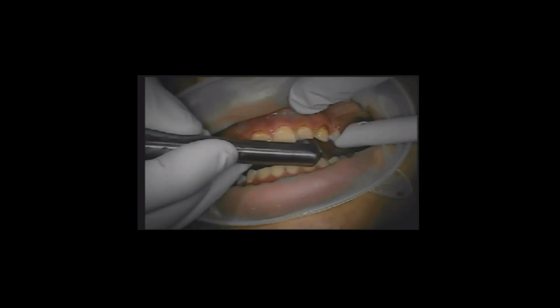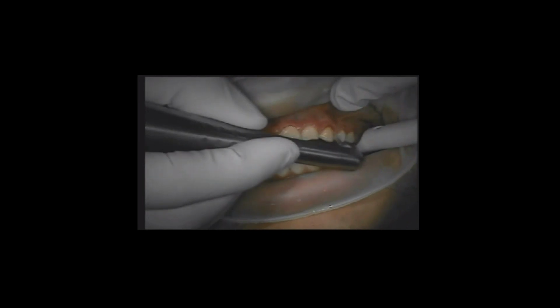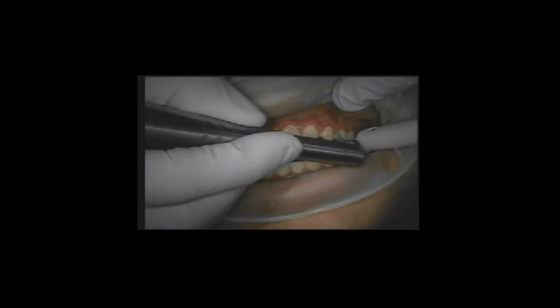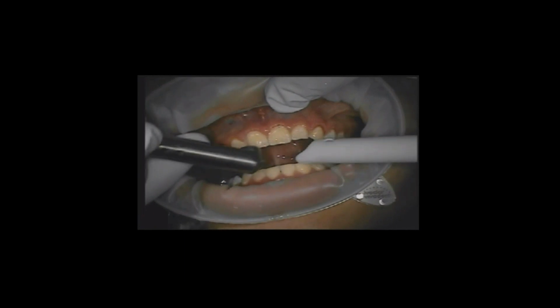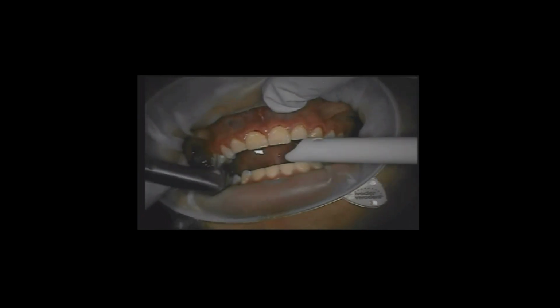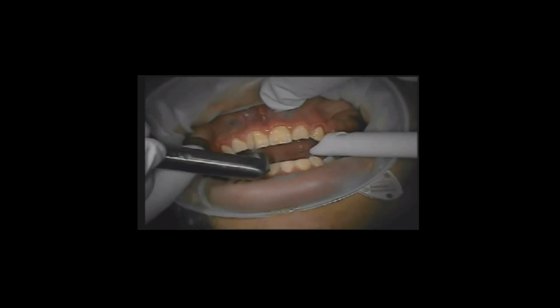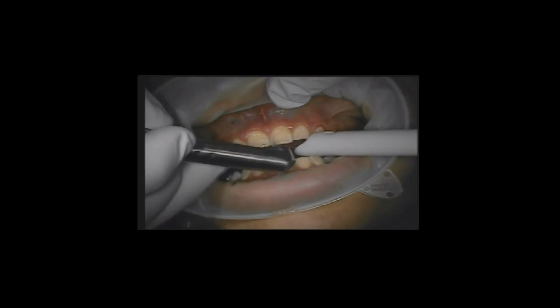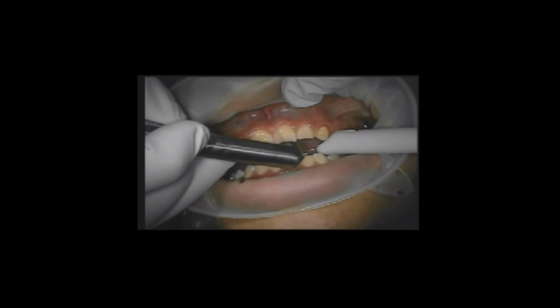So we've gone from doing with no water to now turning the water on a very low setting and just starting to bevel the tissue. So after we trim it to the proper heights, we get a very square edge. Gingival tissue contour is very square, so we want to start to bevel the tissue and do our last little bit of touch-up with it being wet. Again, because, as I said, the zone of necrosis they've shown with erbium laser when you're using it wet is less than 10 microns, which is amazing. Compare that to an electrosurge that we used to use that's well over 100 microns.